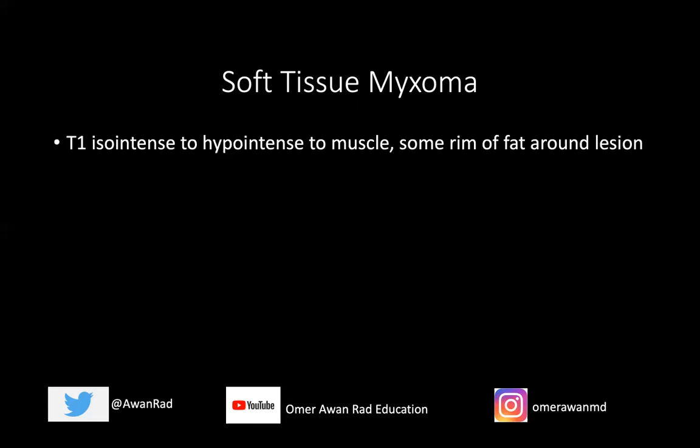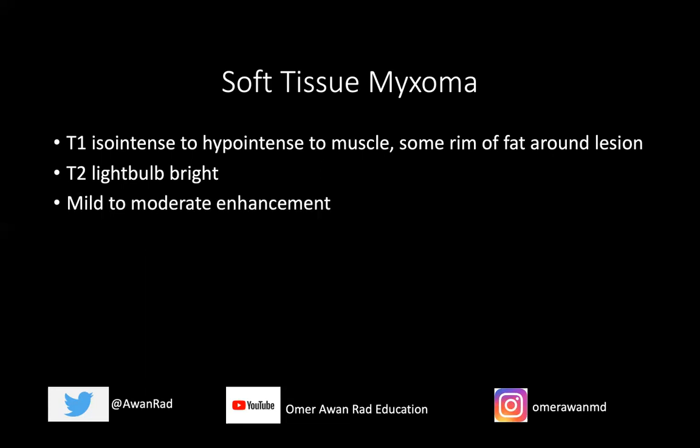On MRI, intramuscular myxoma is typically T1 iso-intense to hypo-intense to muscle. You may see a small rim of fat around the superior or inferior border of the lesion, as we saw in our case. They're very bright on T2 because of their myxoid content. Post-contrast enhancement is very variable — some show mild to moderate enhancement, others show almost none.